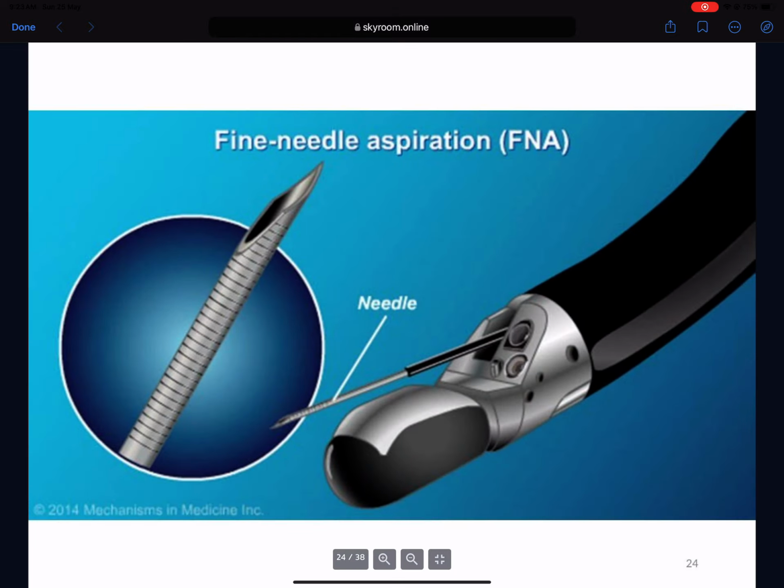You will see the real picture of endoscopic ultrasound. You have a small piezoelectric crystal, which is like a convex in white. You have a small needle, and you can make a biopsy. Also, you have a light, visible light, because it can brighten inside the stomach for you when you want to take a biopsy.